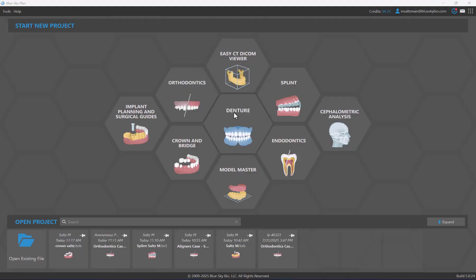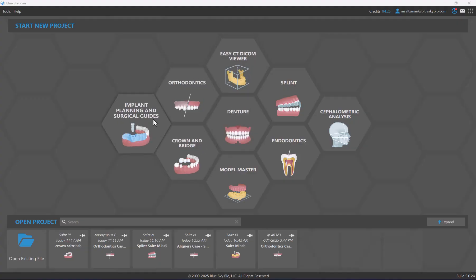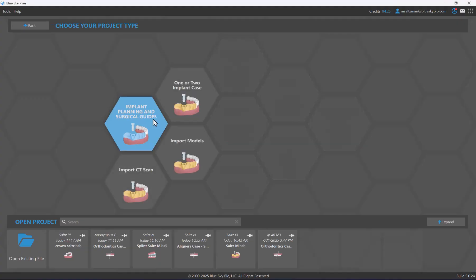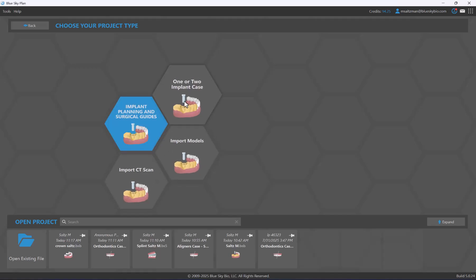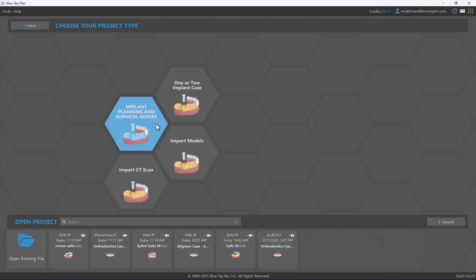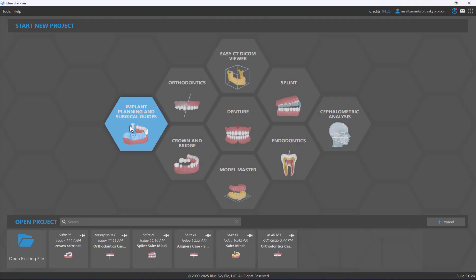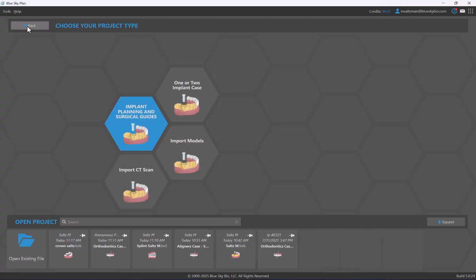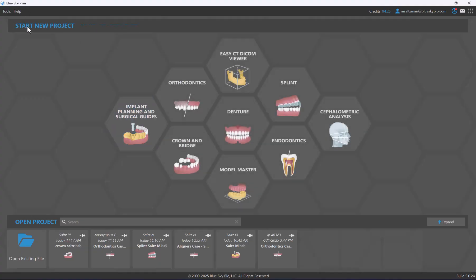Similar to previous versions of Blue Sky Plan, you can simply left-click on the treatment that the patient has come in for, and if there are sub-flows or sub-options you can click on the relevant option to start your new case. If you click once again on the relevant hexagon it will return to the previous screen, or you could click back to return to the previous screen as well.